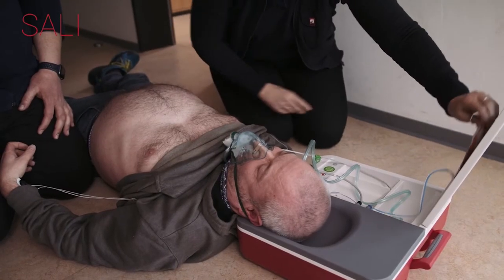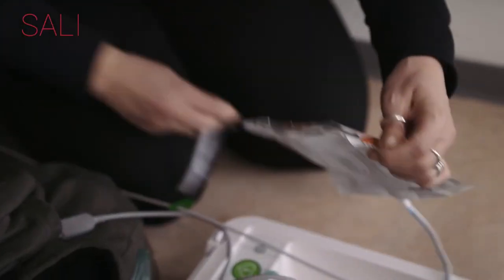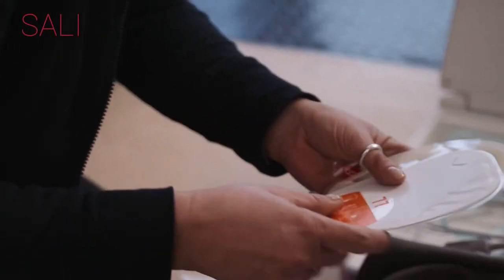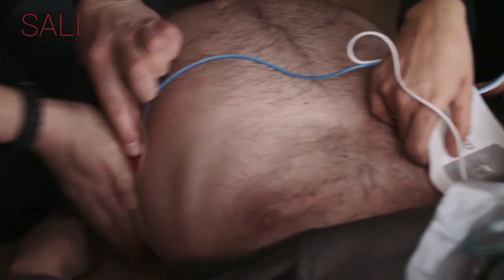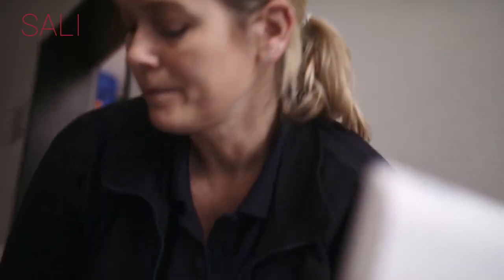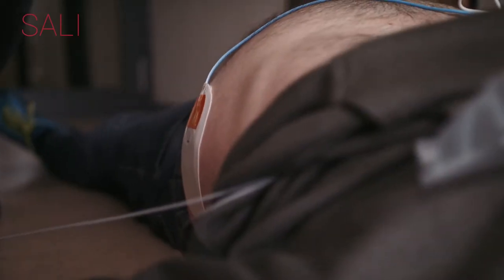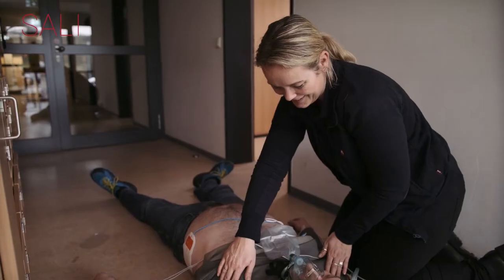Take the pads from the appliance box and remove the protective material from the pads. Put the pads on the chest as indicated and press them firmly on the patient's skin. SALI analyzes the patient's ECG and decides a shock is required. A shock is delivered and the patient regains consciousness.